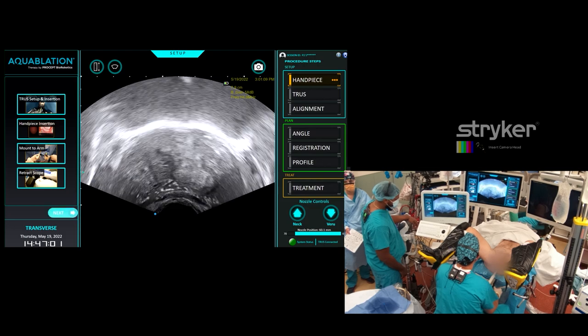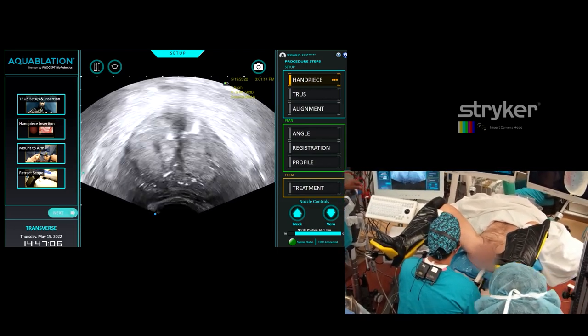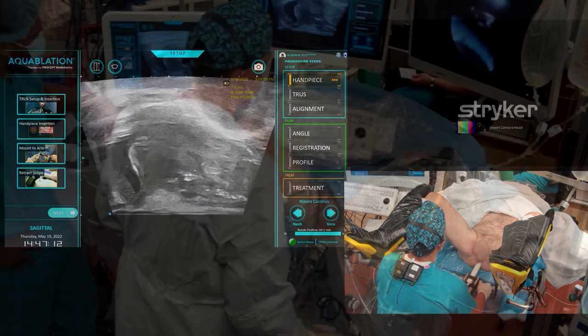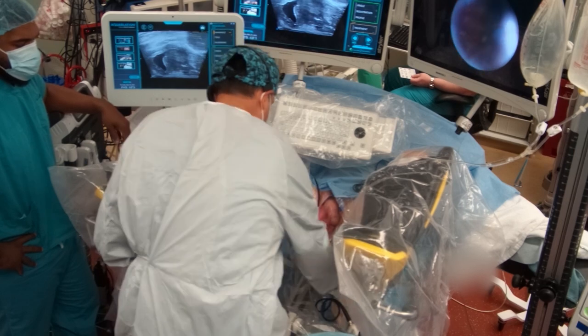I would say about six centimeters. We'll see once we put the handpiece in because the handpiece is seven. You just got a trigger on that to move it — the front. Back and forth. And this is the stepper here. Got my lube.